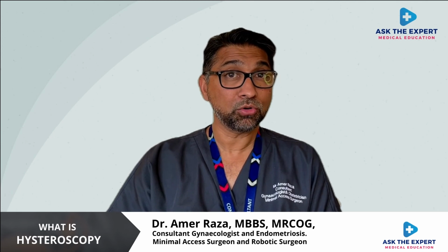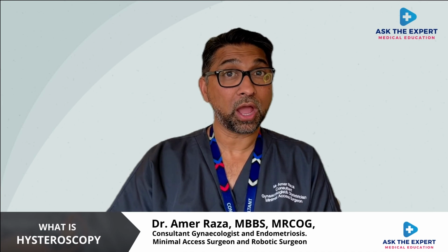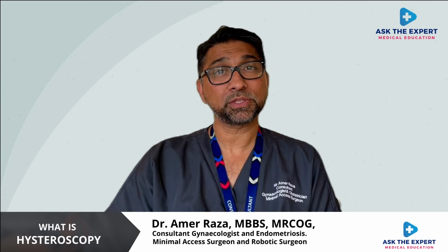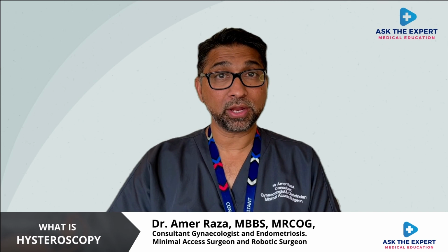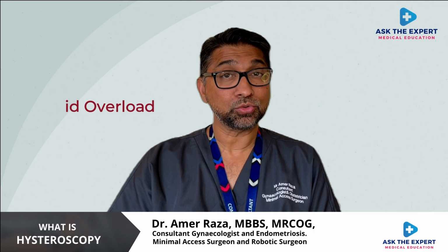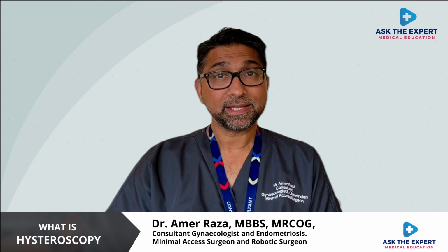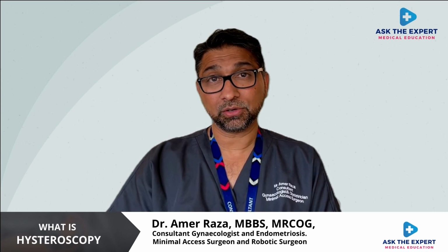Your surgeon will explain all these things to you prior to the procedure. The risk of uterine perforation is very low in an outpatient setting. Along with all these general risks with hysteroscopy, there will be some specific risks associated with the procedure you are having. So, if you're having transcervical resection of a fibroid, your consultant will tell you the risks of fluid overload in addition to risks of injury, perforation, pain, and infection. Lots of fluid is used. We use saline fluid to be able to see inside the uterine cavity and treat the pathology.